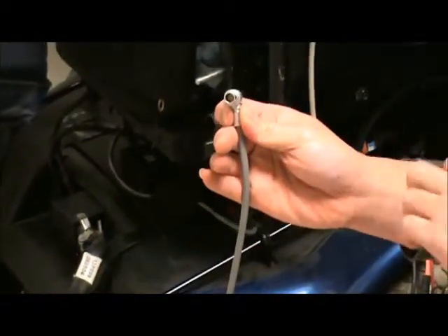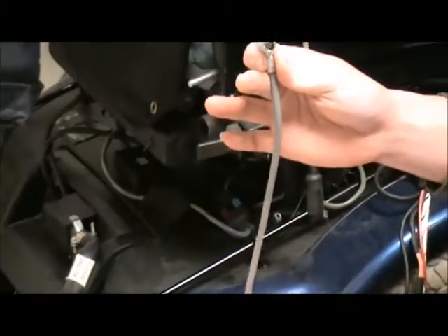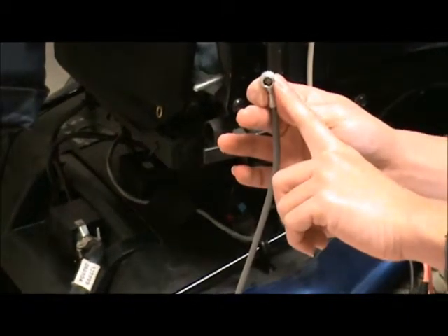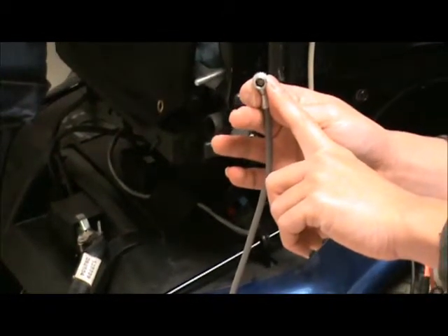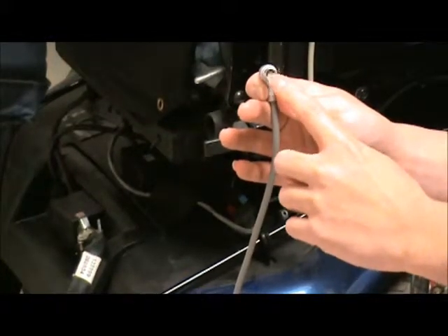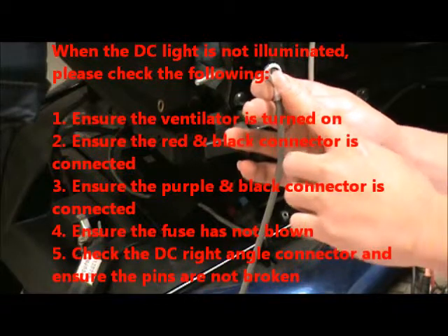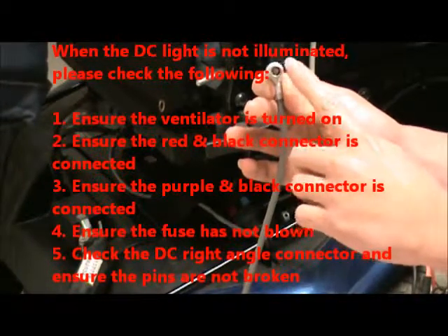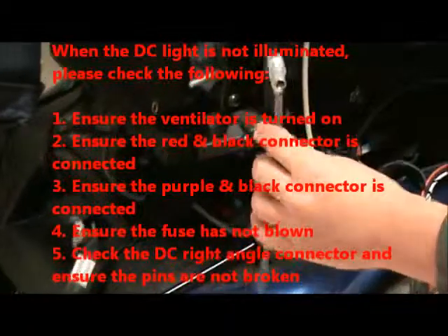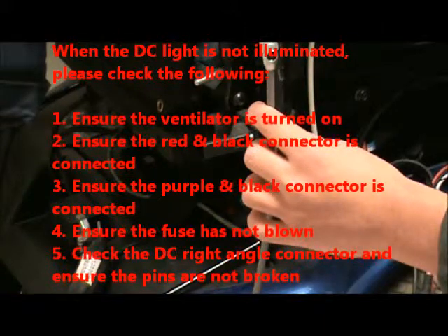The next thing to check is the right-angle connector. If you've checked all the wires and the fuse is in good condition, unplug this connector from the back of the ventilator and look inside the hole. Make sure all the pins are not broken. If a pin is broken, you can call us and we can send you just this part — the connector with the purple and black Anderson connector.